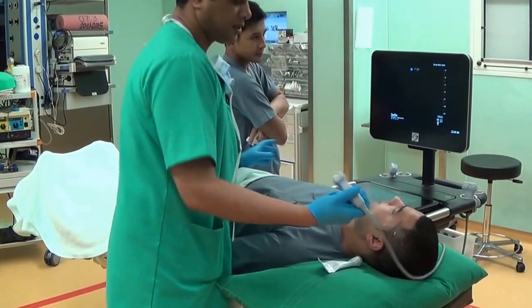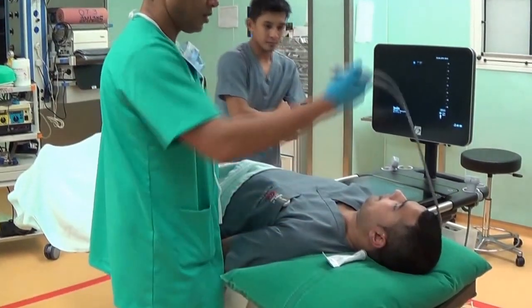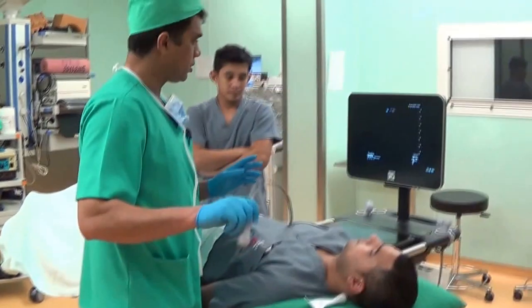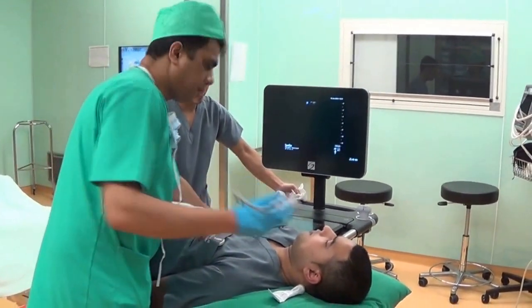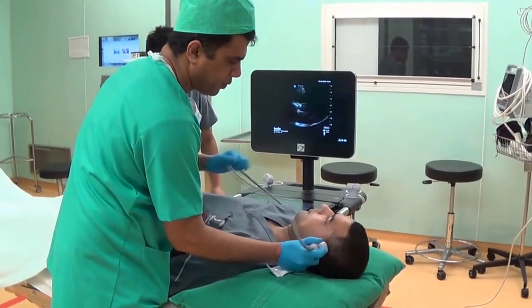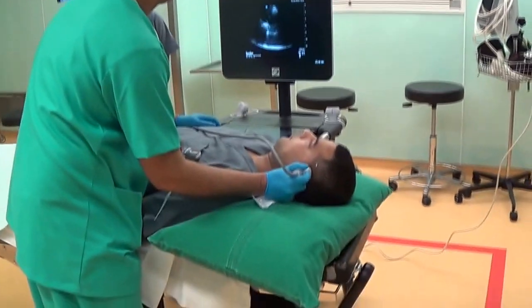This is a transcranial Doppler examination demonstration. This is a phased array probe. We are going to put it over the temporal bone, which is supposedly the thinnest bone of the body.